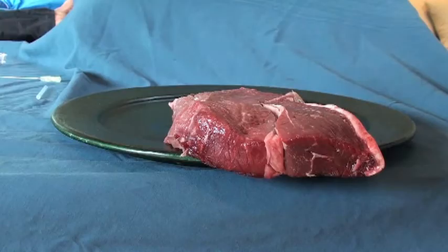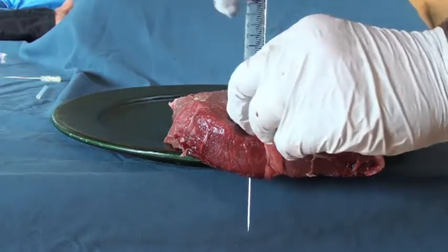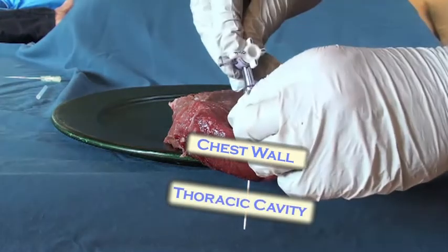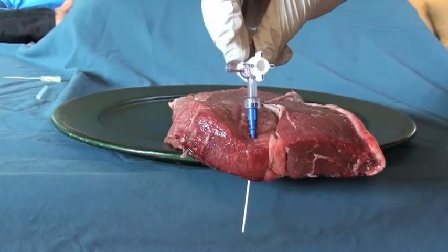Here's what I did. I just opened a central line kit and put in the angiocath over the finder needle through the chest wall until I pulled back some air, and just left the catheter in place. He immediately decompressed and did so much better.